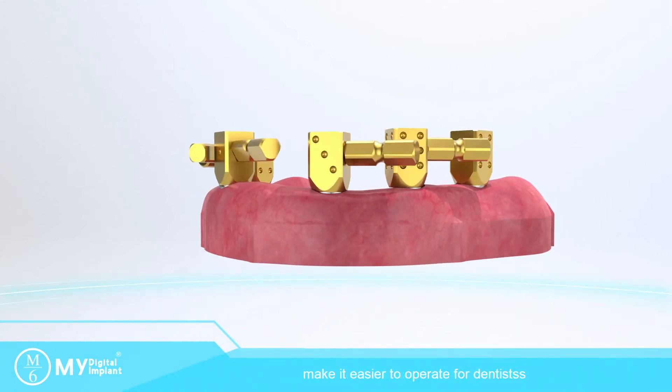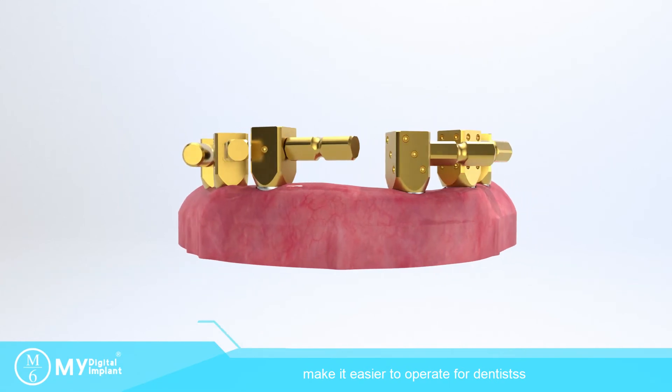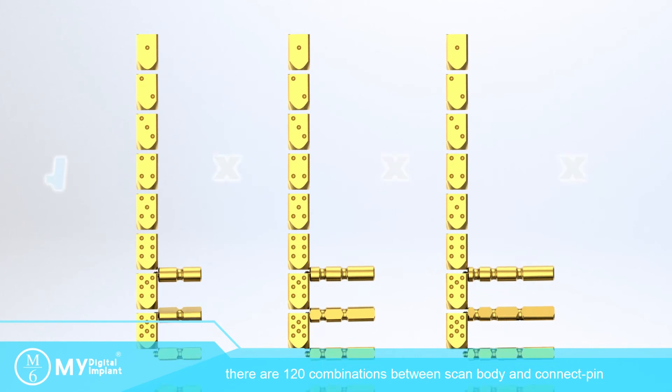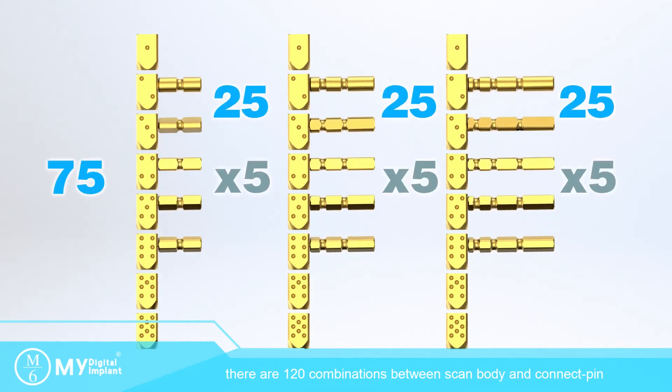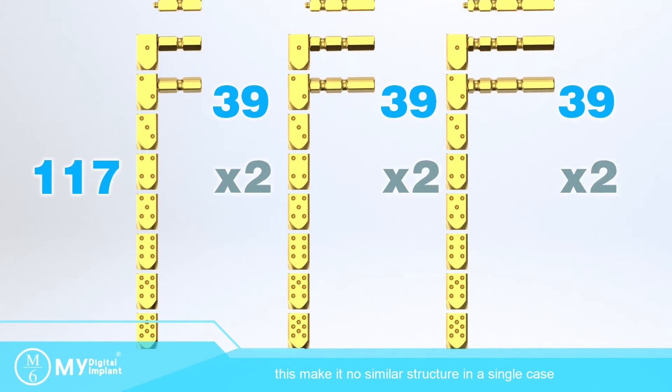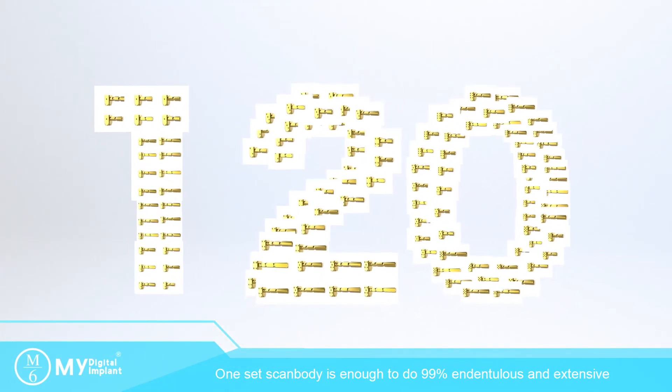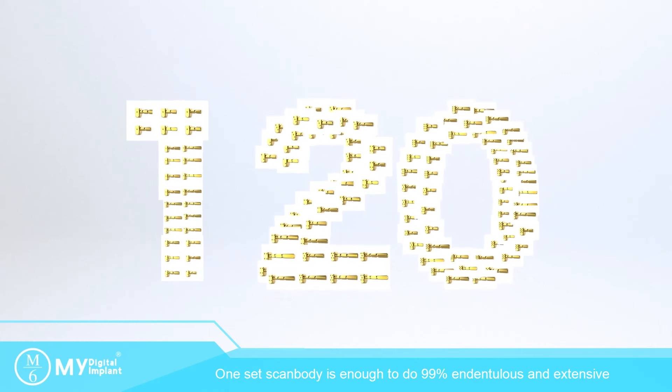This improves scanning continuity and makes it easier to operate for dentists, while also improving the accuracy of scanning data. There are 120 combinations between scan body and Connect Pin, ensuring no similar structures exist in a single case. One set of scanbody is enough to handle 99% of edentulous and extensive missing tooth restoration cases.